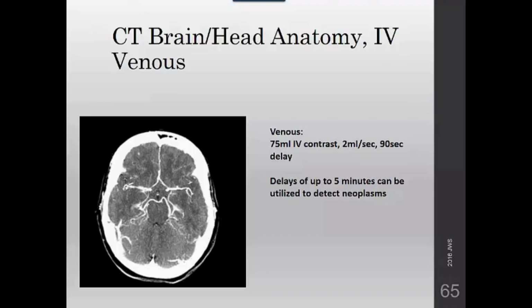The injection rate, you usually use anywhere from 75 to 100 IV milliliters of contrast at 2 milliliters per second. And like I said, you go from a 60 to a 90 second delay after injection.